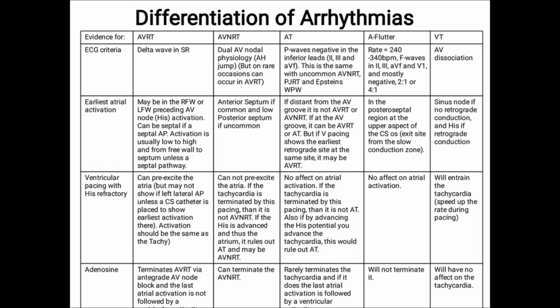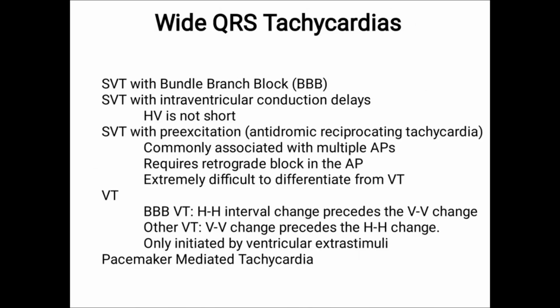Exactly. And to help us on this quest, we've got a sort of detective's handbook, a guide to ECG interpretation during electrophysiology studies. That's going to be our roadmap through all those squiggles. Now, this handbook gives us a 12-step method, a step-by-step way to unravel those ECG mysteries. Kind of like a checklist for our cardiac detective work. It's a good way to make sure we're covering all the bases, dotting all the I's, and crossing all the T's. Right. So, first things first, step one.